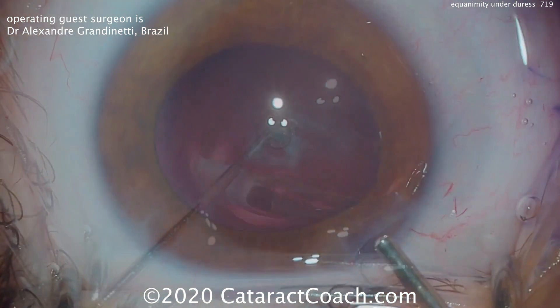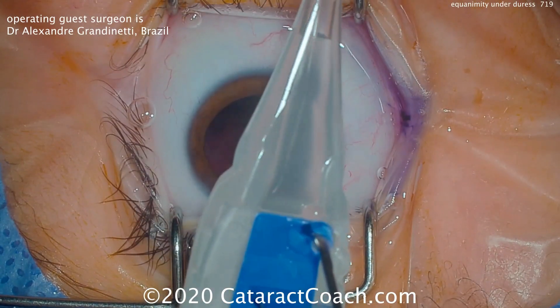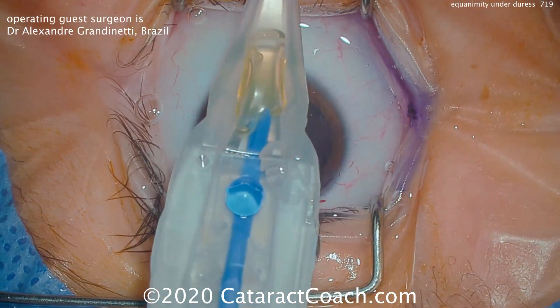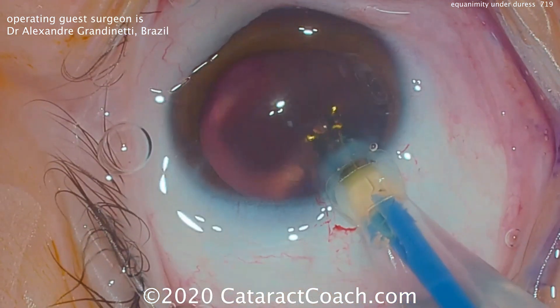That looks great. Now the new IOL is going to be inserted. Fill the bag with viscoelastic. Here's the pre-loaded injector. Viscoelastic is being placed — it looks pretty good. And the single-piece monofocal lens is going into the bag.